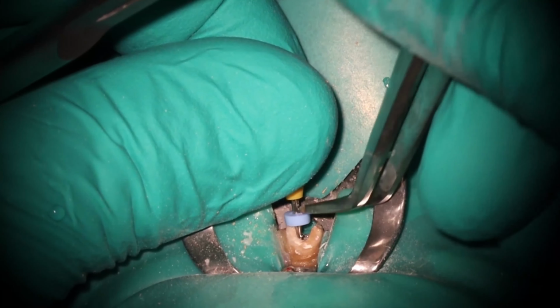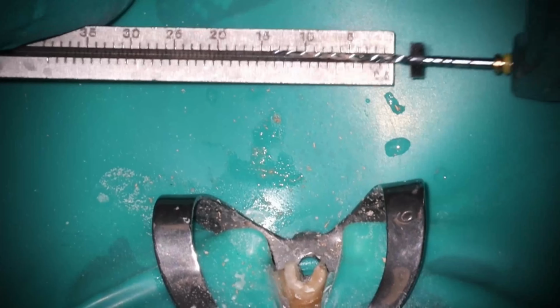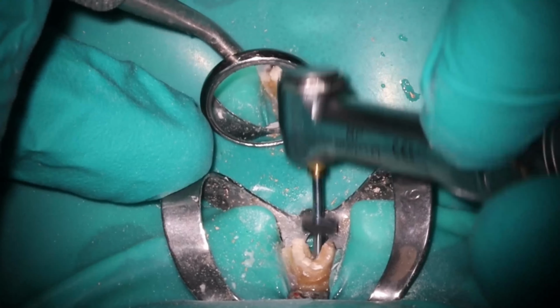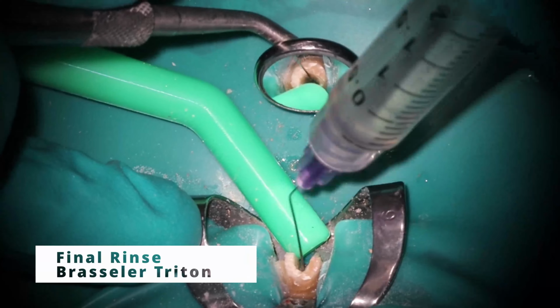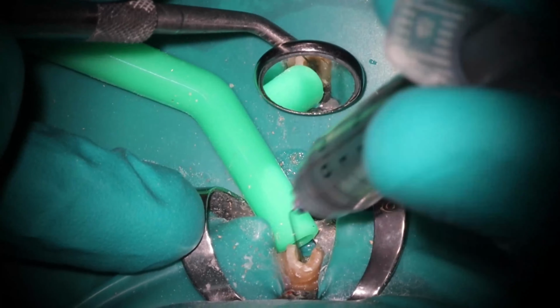So not only did I use the size 50, I'm also rechecking to make sure that I have the exact accurate amount. 18 is our working length, and so I'm going to be going in here. Because this is such a large shape, I will be using a cone for this one for sure. You can see brushing back and forth that makes sure we get anything off of the walls. And at that point, we're done. We're ready to do our final rinse here, so I'm going to use the entire syringe of Triton, get this thing as clean as possible.